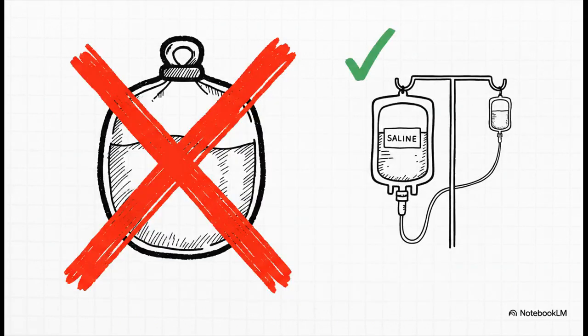And here is a major pro tip that's super easy to forget. Unlike setting up an A-line or CVP, you do not need a pressure bag for this. Nope, we're just using a simple gravity and manual flush system here.